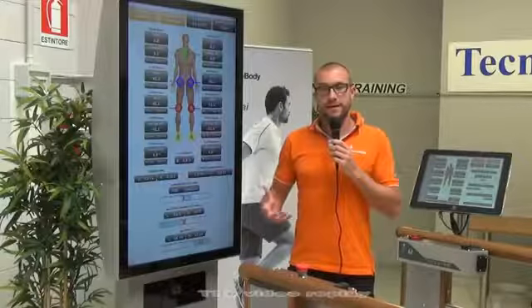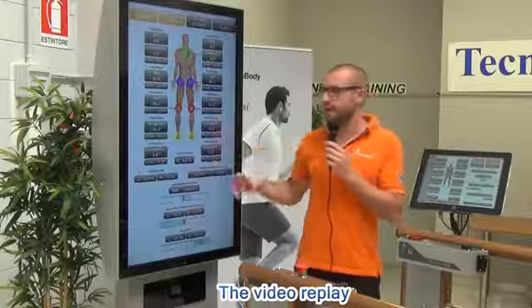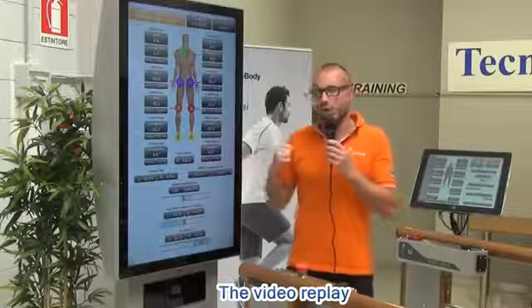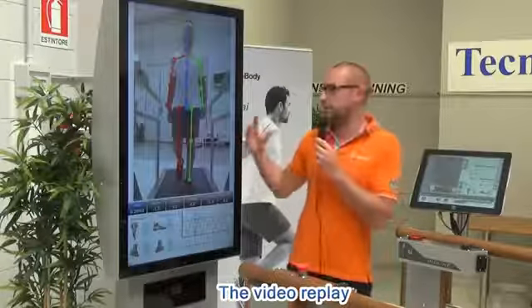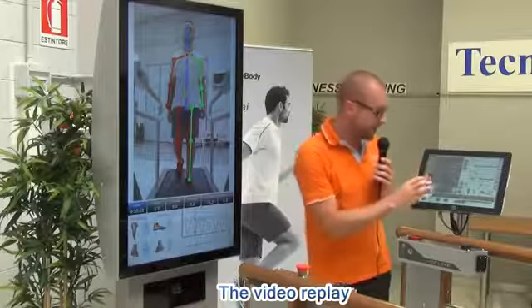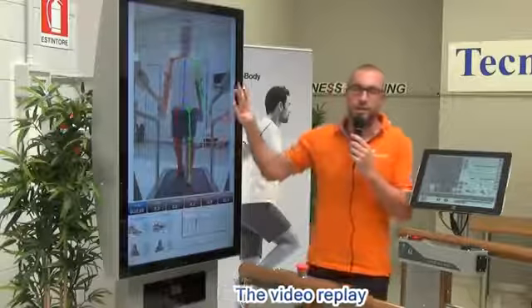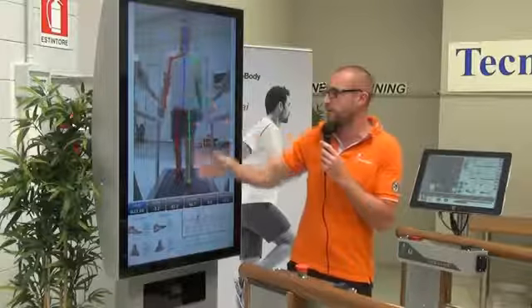After the gait analysis test, the software provides in real time a final report with all the information that we analyzed before. But another part of the report is about the instant replay. On top of all the data numbers that the software provides, we can give another kind of information and a kind of feedback through the instant replay. Replay that can be set with different kinds of speed.